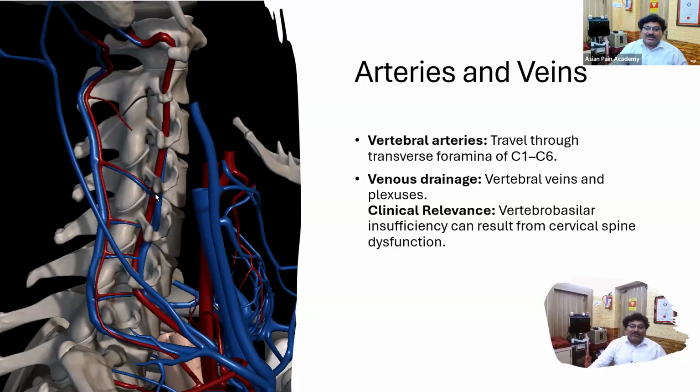So in every case, we have to be very careful about the location and position of this artery. Remember, in the days of fluoroscopy only, when we did not have ultrasound, we were not able to see this artery, so there was more possibility of accidentally injuring it. But nowadays we work under ultrasound guidance and usually see the artery along its course.